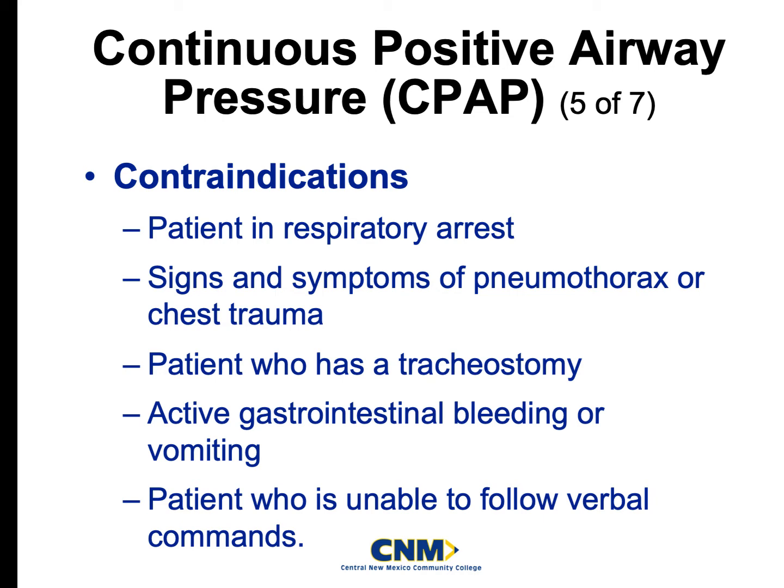Anybody that has any active GI bleeding or vomiting, specifically, even if they are saying or complaints of nausea at the basic level. Now, that's going to change when you move up, because when you get to intermediate, you will be able to give medications to help patients with their nausea. And you will be trained to give those medications prophylactically before you actually put them on a CPAP. But for now, at the basic level, you cannot hook up the CPAP for anybody with even the complaints of nausea, okay?